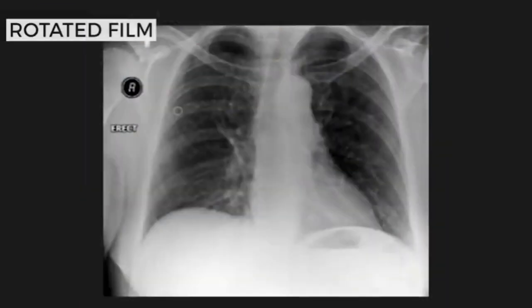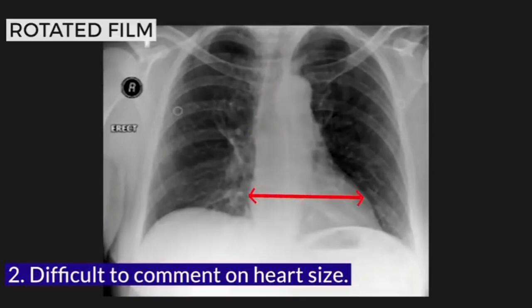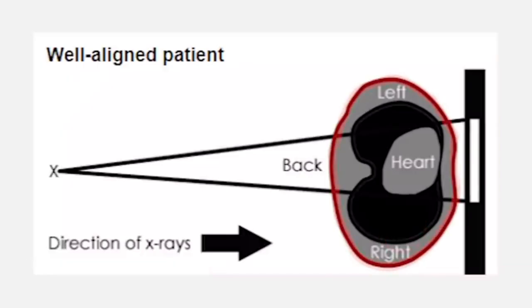Okay, what are they? First, you check the image quality with the RIPE framework. RIPE, got it. And the second? Second, you interpret the anatomy with ABCDE. RIPE makes sure the image isn't lying to you, and the alphabet makes sure you don't miss the pathology. So if you skip RIPE, the rest doesn't even matter. Exactly. Let's start with that quality control check then.